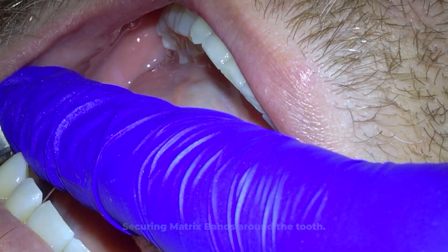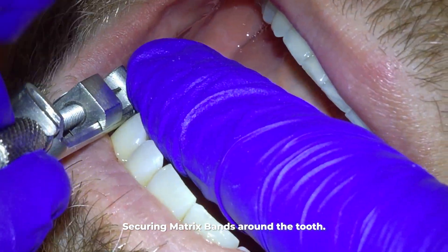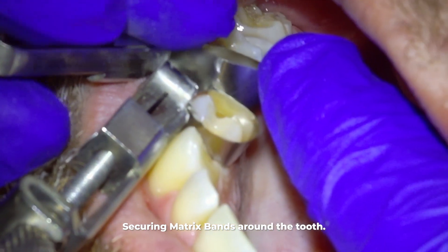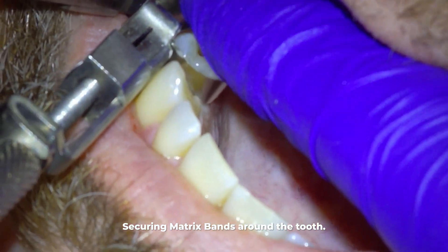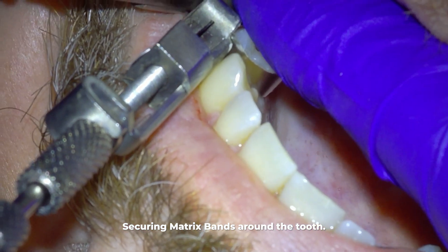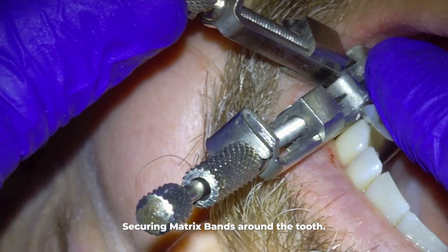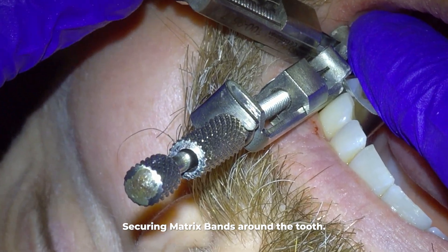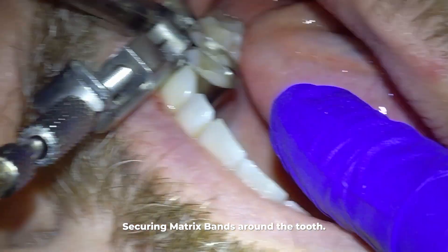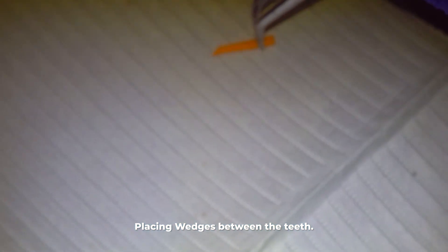In the filling process there are many step and product variations for everything from here out, so your dentist will do things a little differently. I like this classic matrix because it is solid and doesn't break or loosen like other newer models do.